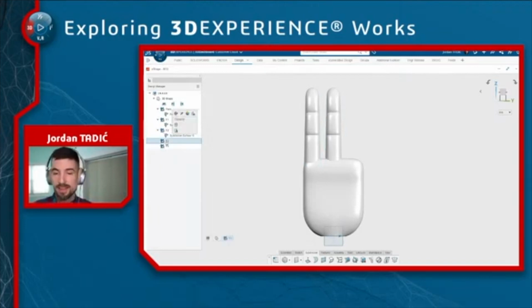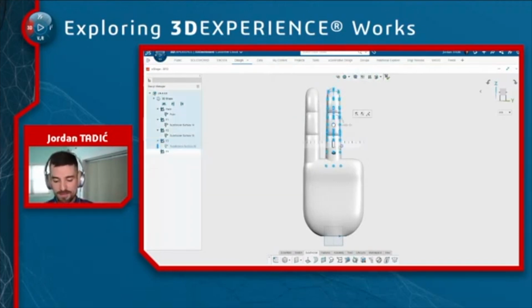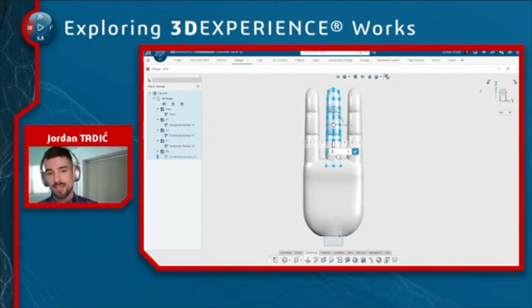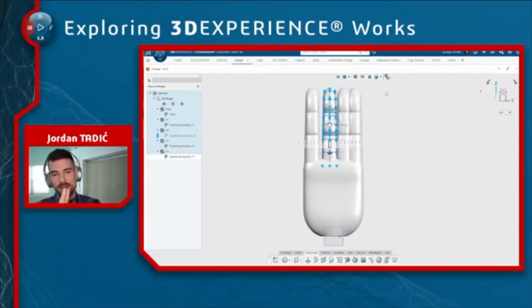Now I'll duplicate that one, move it 28 millimeters over to the right to be on the opposite edge of the palm. And then I'll create one more duplicated copy of this so that I can create the ring finger to go between the middle and the pinky finger. I moved the other one 28, so I obviously have to move this one 14 to center it up. So that's why those parametric numerical inputs are really useful. Now the gap, we wanted a gap between the index and the middle finger, but not that big.